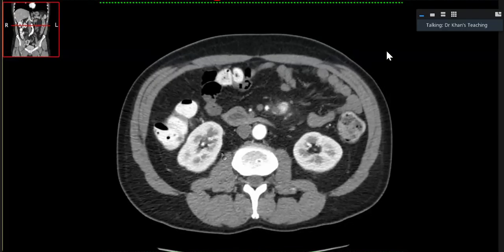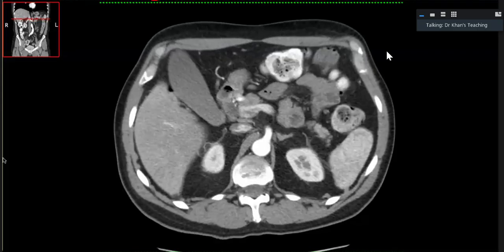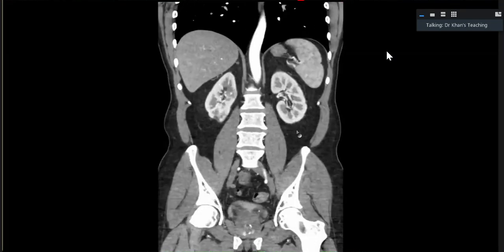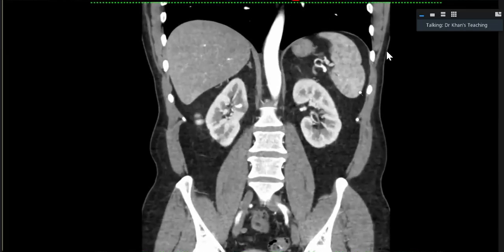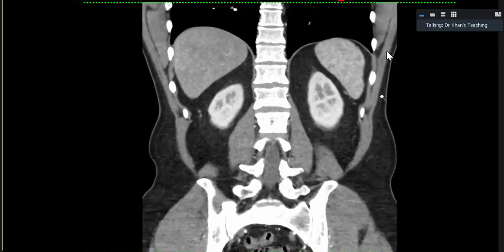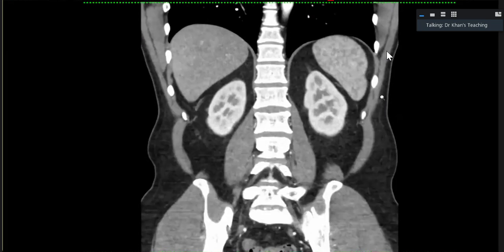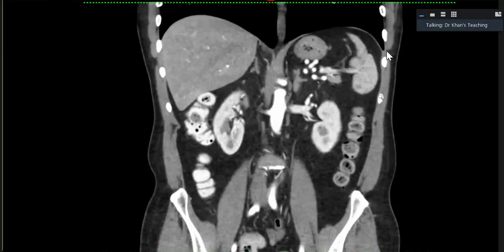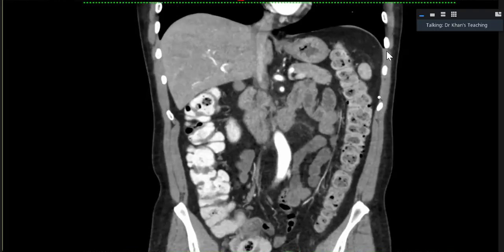And now in this particular case, if we go for a coronal, in abdomen, there is absolutely nobody stopping you to ask for a coronal. If the examiners want to show it to you, it's fine. They will show you. Otherwise, they will not show you, but you are absolutely justified. Where it is relevant, please ask for coronal. Just think in your clinical practice, what do you do? And there are places in which coronal will be very helpful.